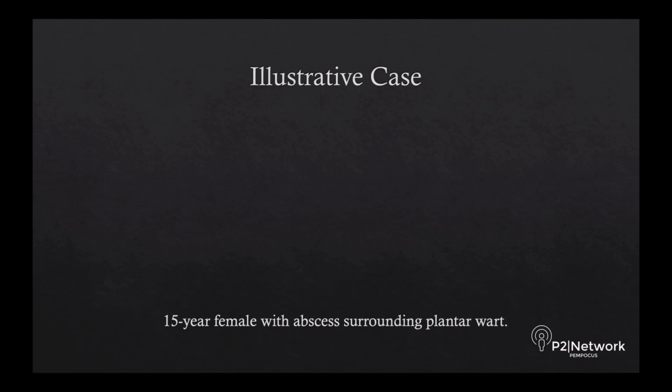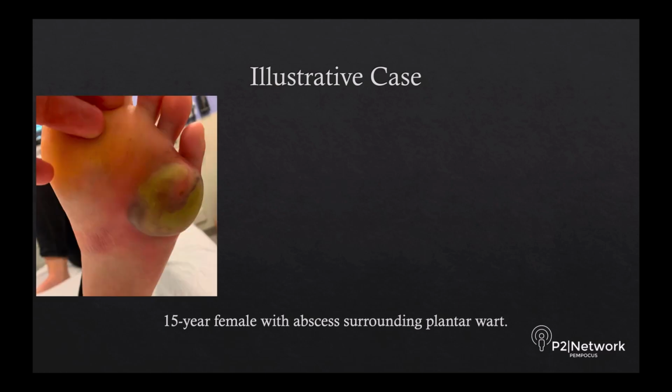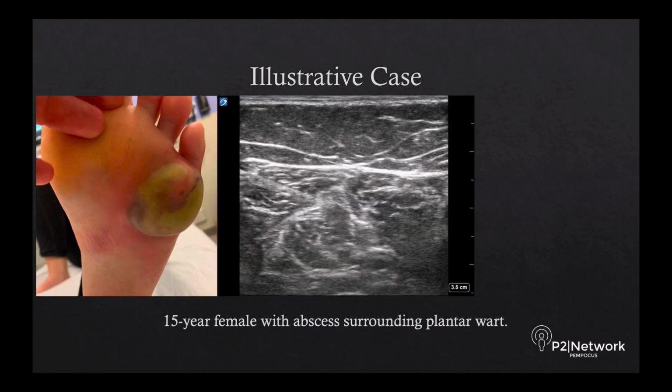Our first case is a 15-year-old female with an abscess surrounding a plantar wart, as shown on the left here. You can see your abscess, as well as some spreading erythema extending up around the arch of her foot. We discussed with the family pain control and consented for a posterior tibial block. Here you can see a view of the block in process. We're just above the level of the Achilles and transverse axis.